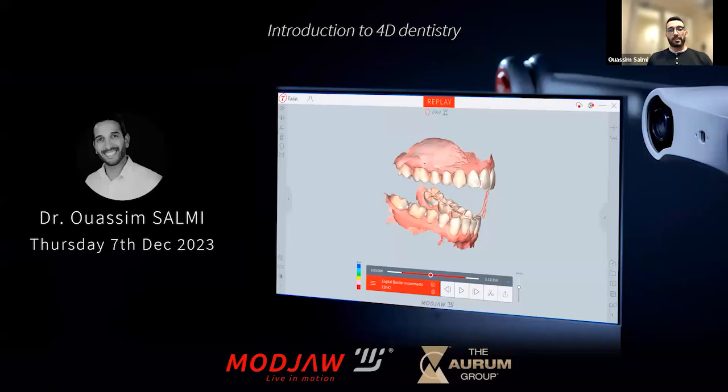So we are going to exchange a little bit, and I will do an introduction to 4D dentistry. When we talk about 4D dentistry, it is when we add time. We add time to 3D dentistry. So 3D dentistry, 3D models; 4D dentistry, 3D models moving in real time.